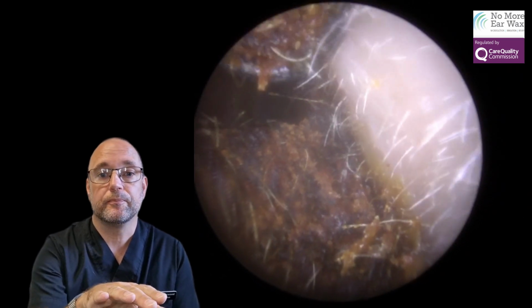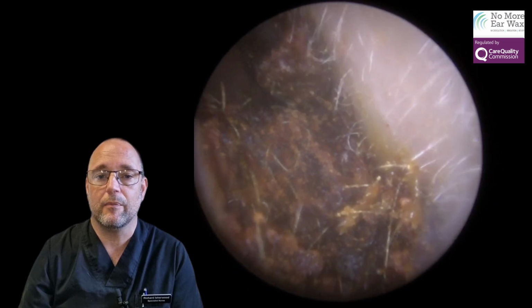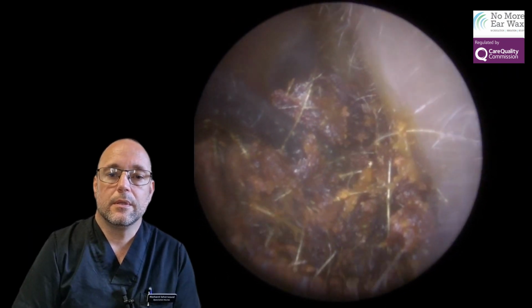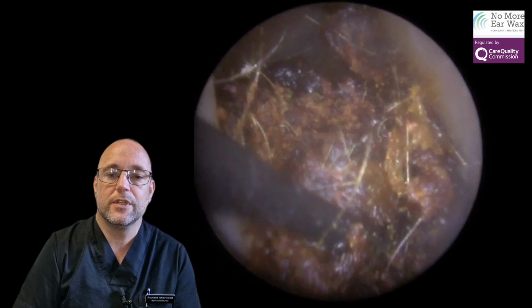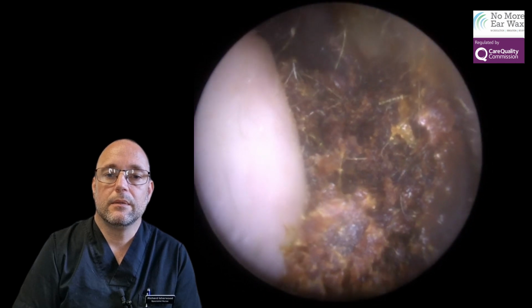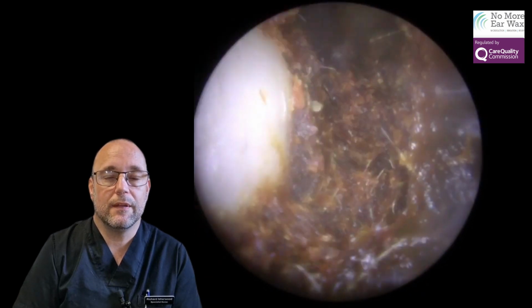You can see that gap now. You could probably see it before, but if I could just get behind that gap there, and then scoop it around, and again it's breaking through it again. It's desperate to come, as you can see, but it's just stuck. There we go. It's quite some force as well that you have to put into this.